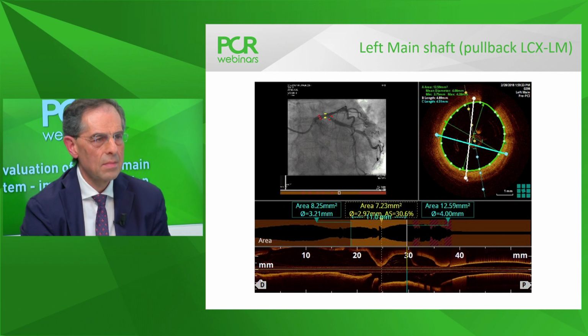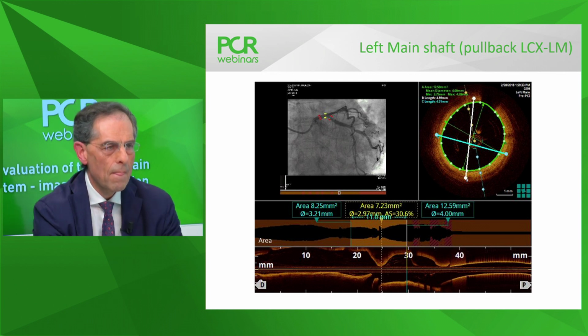Thank you, Giulio. Can I just abuse your experience and knowledge in imaging in addressing the questions that have just come from the colleagues? Can you tell us about reference cutoff values in terms of MLA for OCT and for IVUS? When would you define significant left main stenosis based on these imaging techniques?